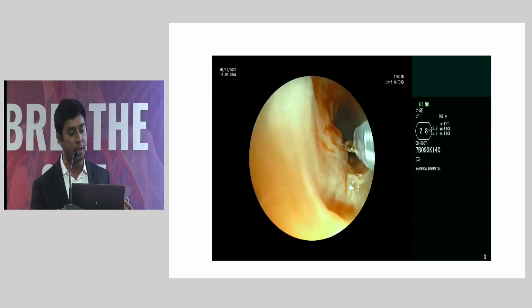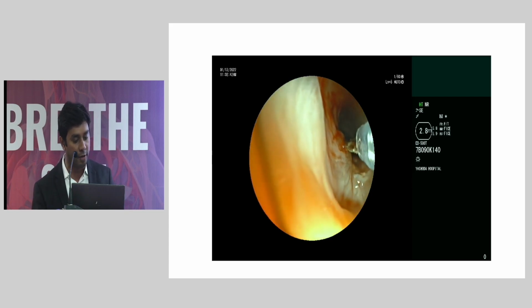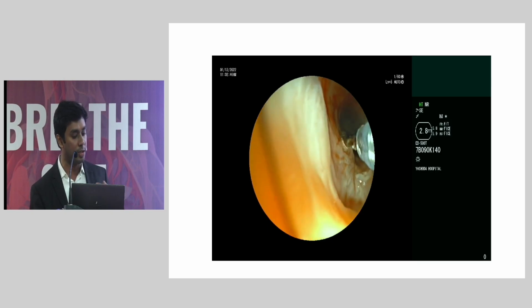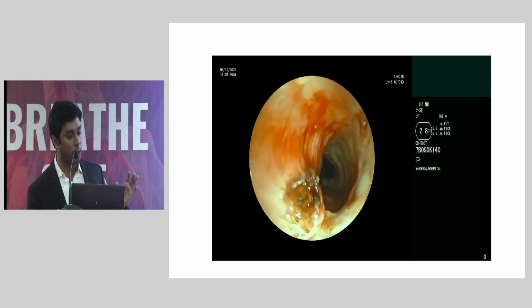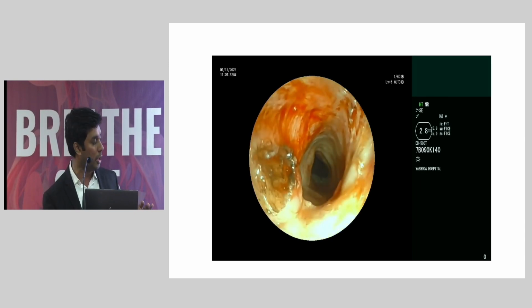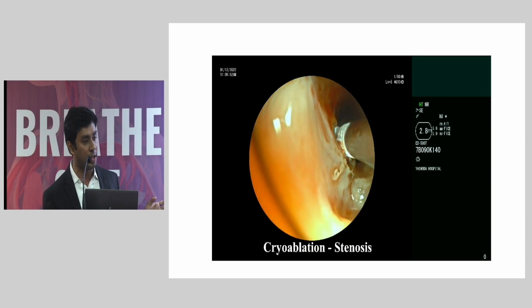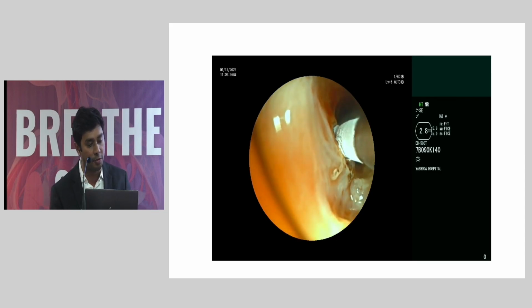So what we are doing here is making electrosurgical incisions with the help of the electrosurgical knife, and we are trying to open up the stenosis, thereby preventing this stridor from happening. The important point is that even when you do any of these bronchoscopic methods, you need to keep this patient on follow-up, because the chance of recurrence is going to be high. So to prevent the recurrence, what we are doing is called a cryoablation of the stenosis. This is something which we started at our center.